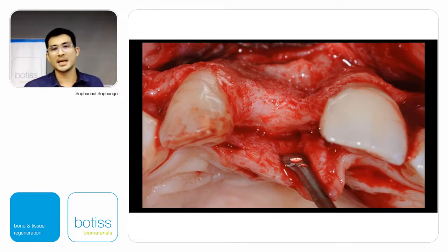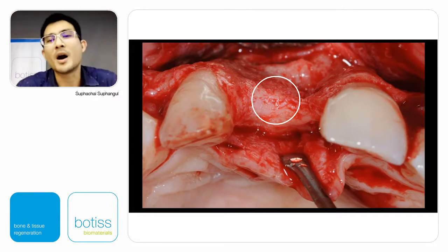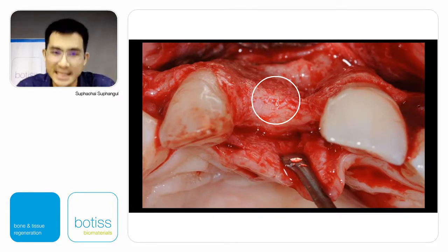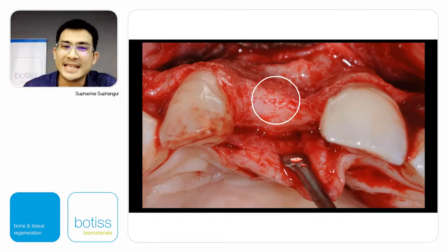Let's say in this example, in general, the circle is the same as the platform of the implant. In general, we need this circle, but we need bone support. From Spray 2000, we need 2 millimeters more to support this area.